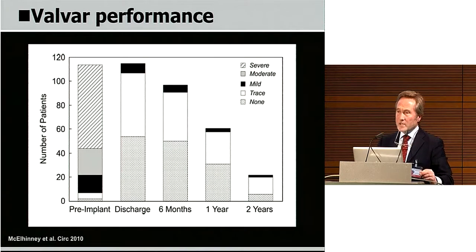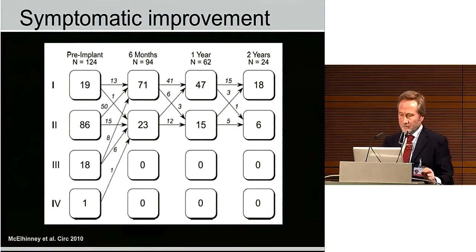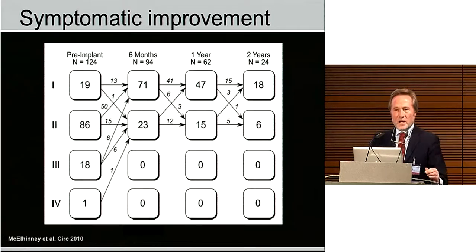Well, the same results have been reported by McElhinney for the US experience. The valve is competent very nicely during follow-up, and those are the same results as in our own experience. I mean, the competence of the valve is not a problem, not immediately and not during follow-up. Well, the patients are doing well.